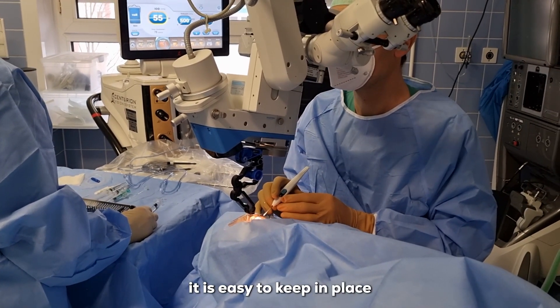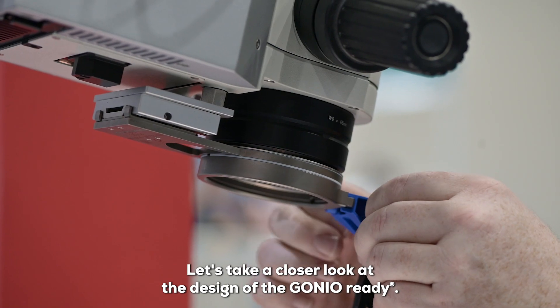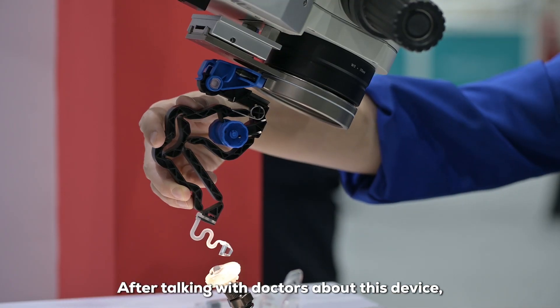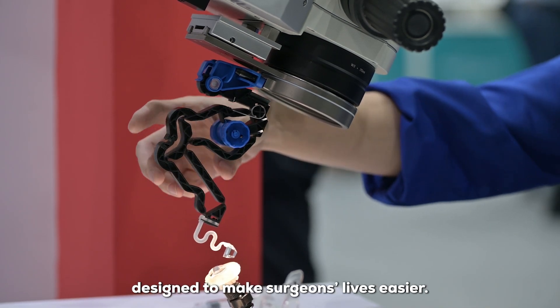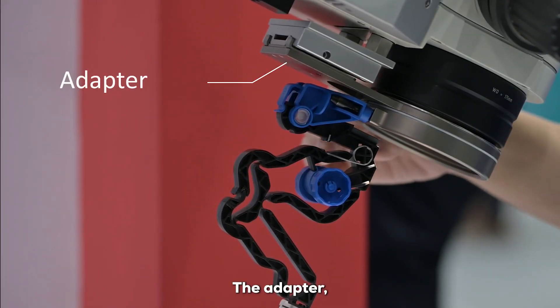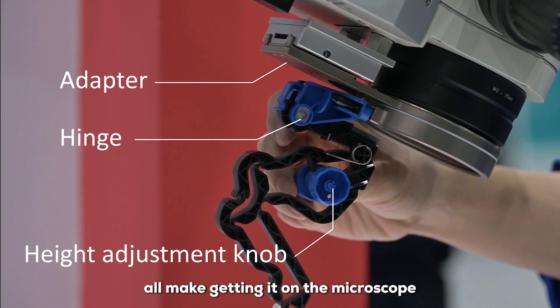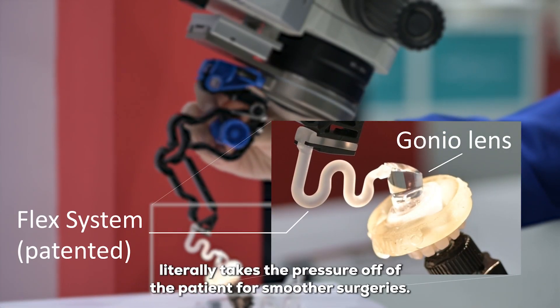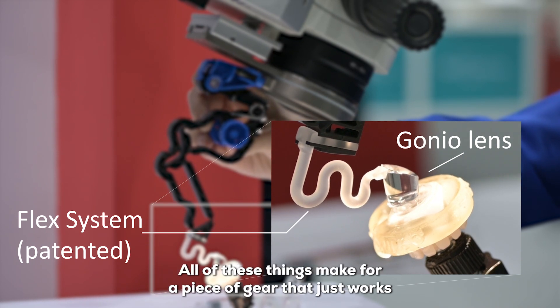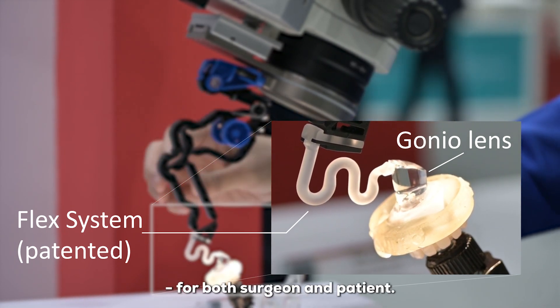The GONIO Ready lens is easy to keep in place and to maintain its position during surgery. The adapter, the hinge, and the height adjustment all make getting it onto the microscope and into position a breeze. The patented FLEX system literally takes the pressure off the patient for smoother surgeries, making this a piece of gear that just works for both surgeon and patient.